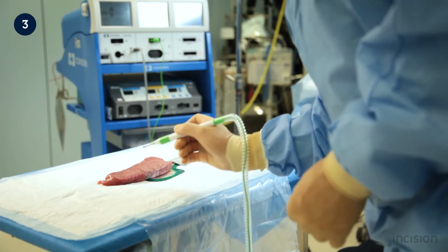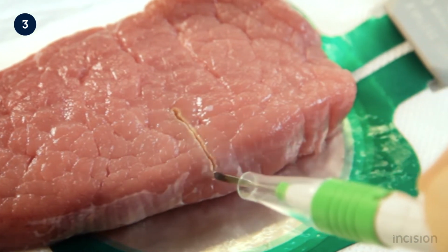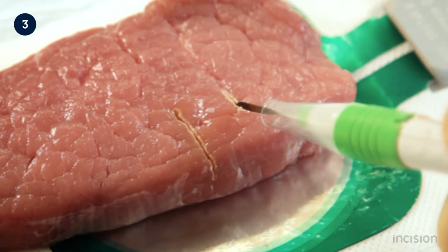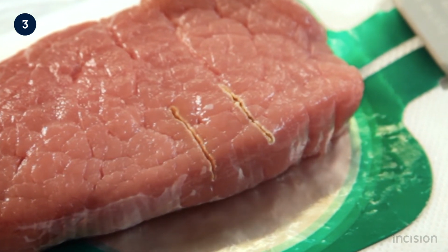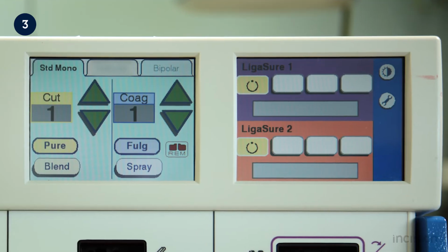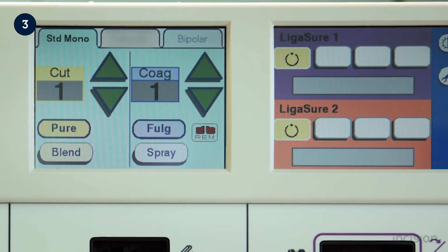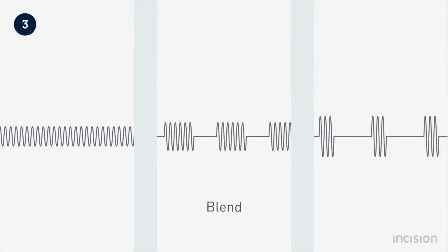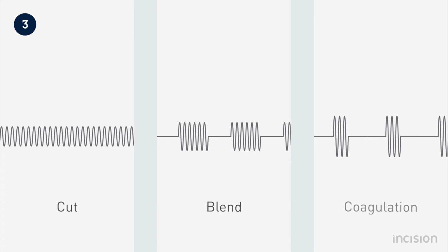The effect of these waveforms on the tissue is clear. With a cut waveform, little charring occurs and a clean cut can be created. In contrast, the same conditions with a coagulation waveform result in maximum hemostasis. It is also capable of cutting tissue as the voltage is above 200 volt, but is less suitable for this application. Aside from this, a large number of alternative waveforms can be created to suit different intended tissue effects. Common are so-called blend modes, in which the activation time and voltage of a waveform is adapted to create a certain combination of cutting and coagulating.